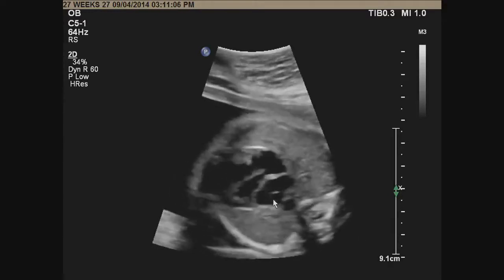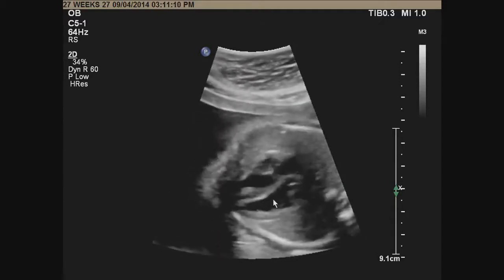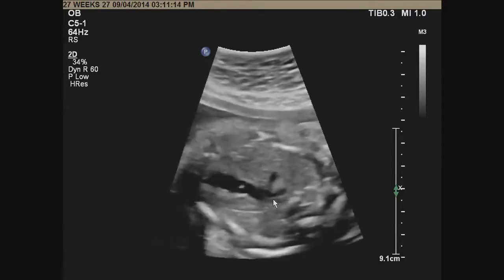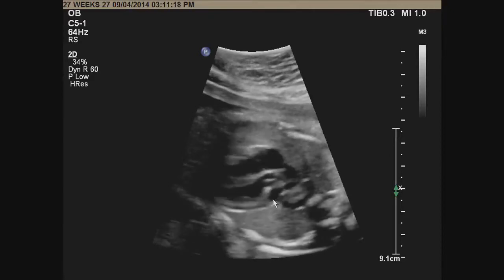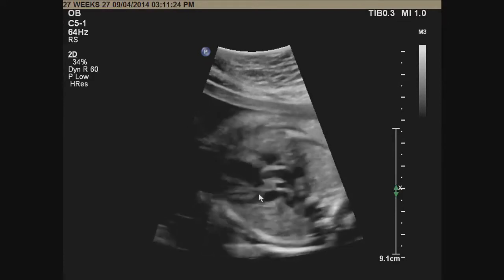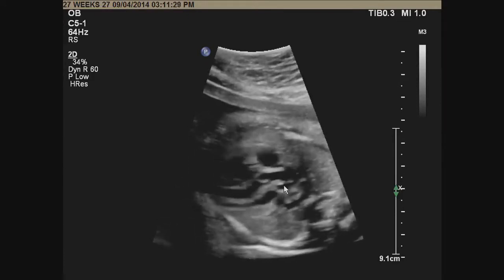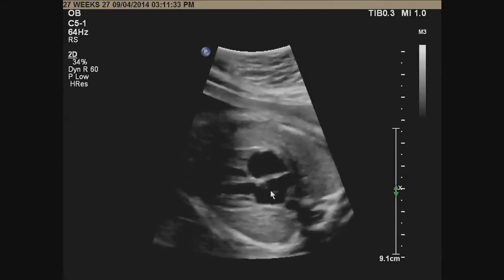So these are the planes that, at the level that you are at, my recommendation is to become very proficient in them, because it would help you tremendously in ruling out major abnormalities, especially related to transposition and all these things, because it's so critical. Many of those, when I go and look back at many of the transpositions that have been missed, many times you see that the division of the pulmonary artery, which could be very, very subtle at this level, is missed.